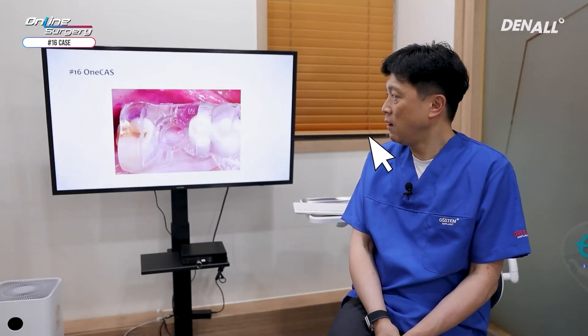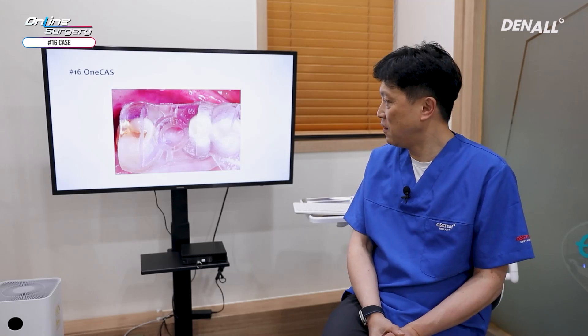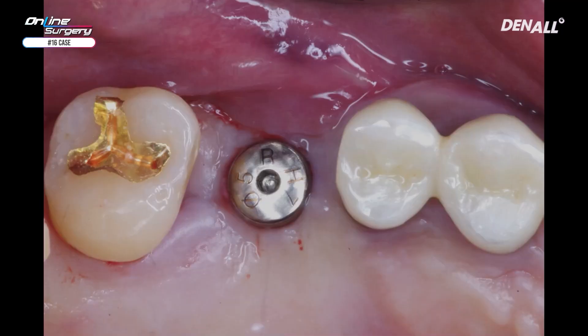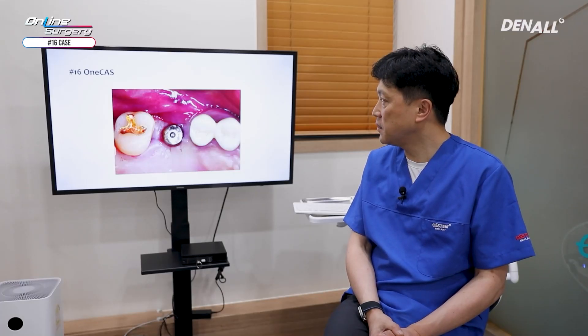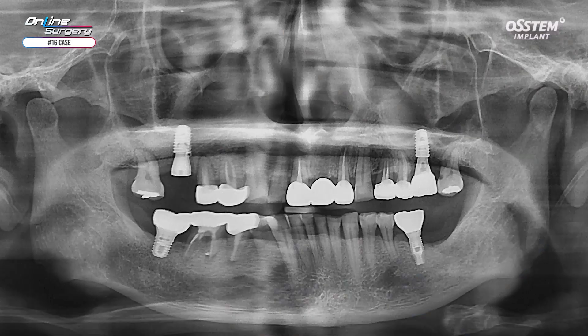Did you enjoy the surgical clip? When you use one CAS kit for surgery, there's not much to see in terms of the surgical clip. The template was adapted before surgery, the implant was placed nicely, primary stability was sufficient, and the healing abutment was connected. Surgery was closed and if you look at the panoramic image, the implant was placed like this.